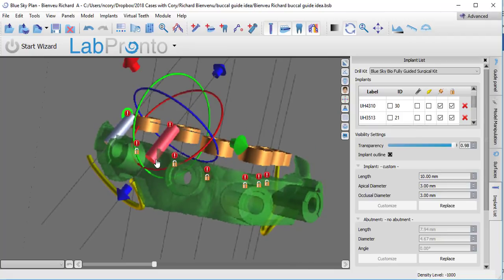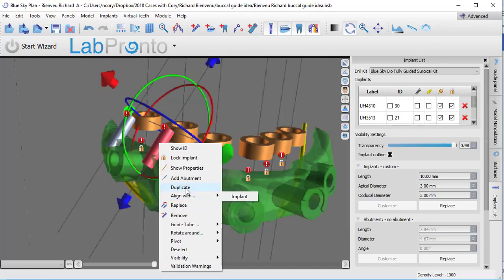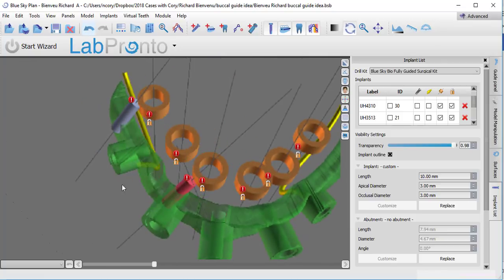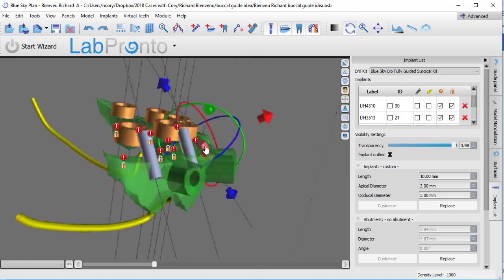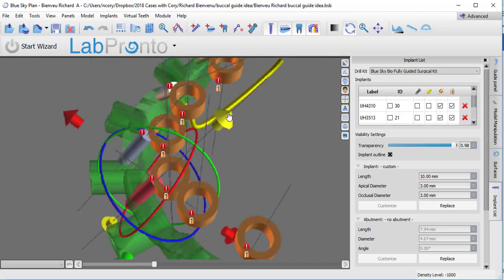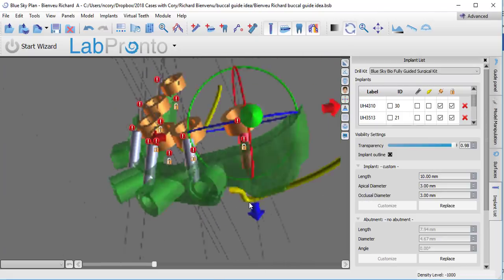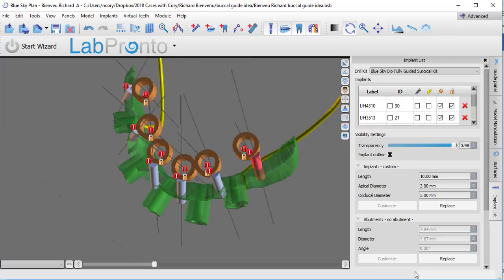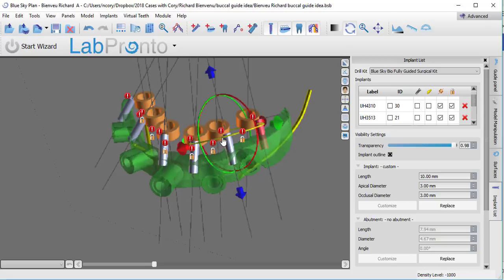And I don't worry too much about the fact that this is sticking out. Remember, it's resin. When you print this, just grind that off if it annoys you. But there's no reason it can't just stay there. So duplicate again. Okay, so now you see I've just repeated that process of duplicating and then orienting these custom implants to where they connect both the tubes up here as well as the guide down here.